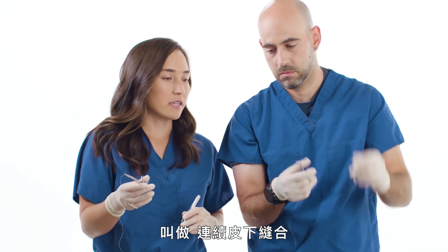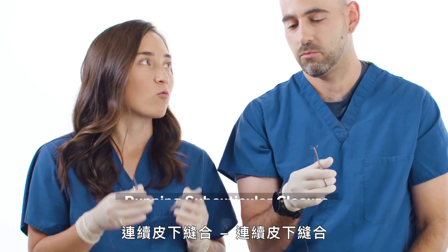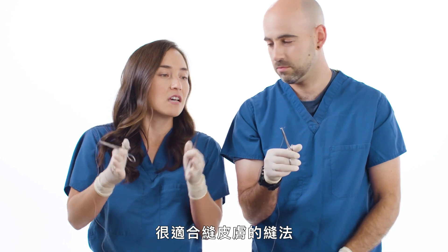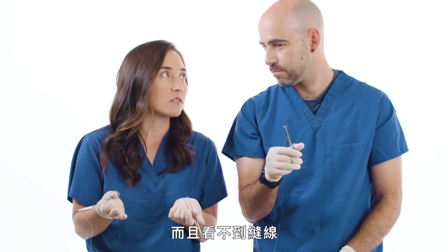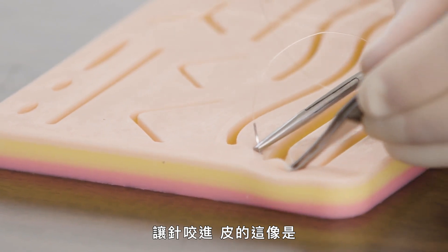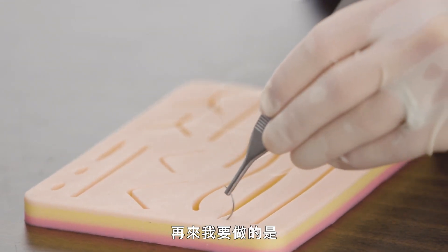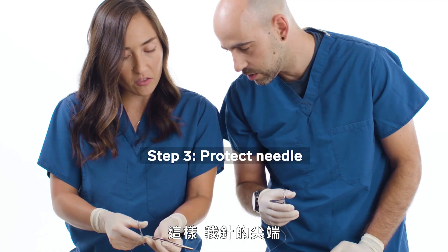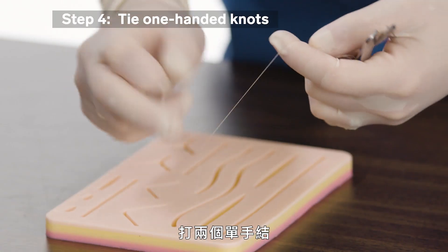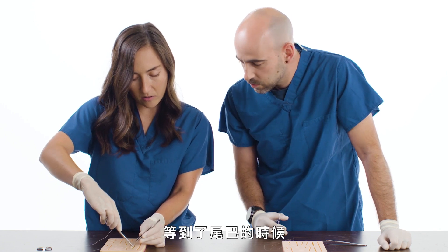What I'm going to teach you now is called the running subcuticular closure. Say it with me: running subcuticular closure. This is a nice way to make the skin come together with no stitches visible. I'm going to pick up the edge of the skin, take one bite right in the apex, then protect my needle — the sharp end of the needle is protected against the pickups — and do a couple of one-handed ties, usually three or four. When you get to the end, I'll show you what to do.